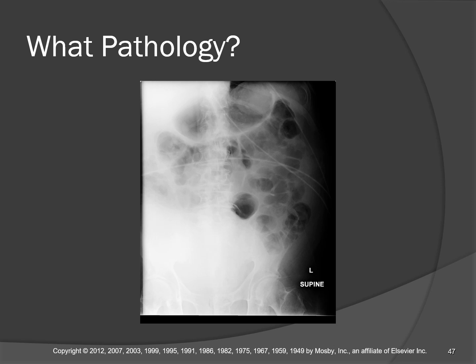What you're viewing here is a massive hematoma in the peritoneum. The liver shows up medium gray because it's so vascular and it's carrying so much blood. It's the iron in the hemoglobin that is actually attenuating the X-ray in the liver and making it show up as a medium gray blob.